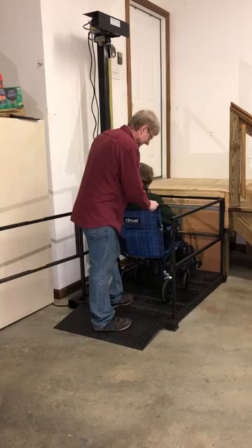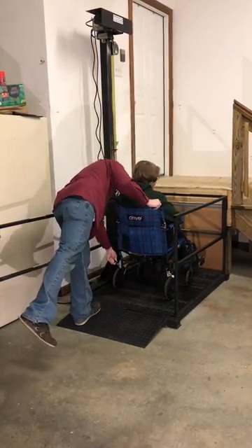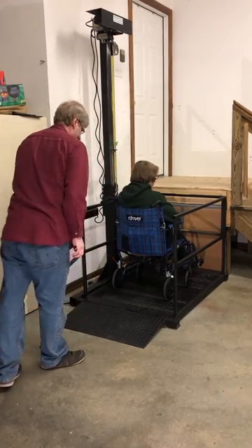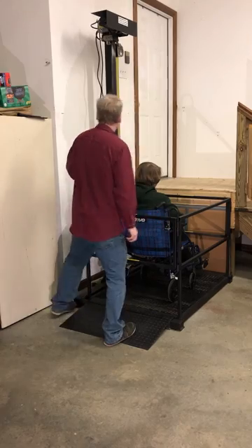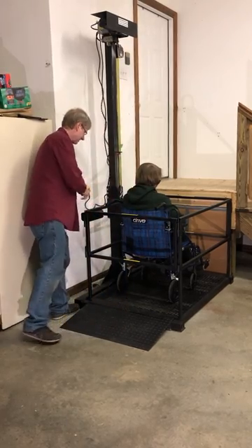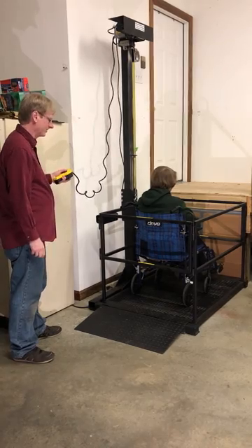It's a good idea to secure the wheelchair or the transport chair. And then you shut the door. Then you take the controller and you go up after all the gates are shut.